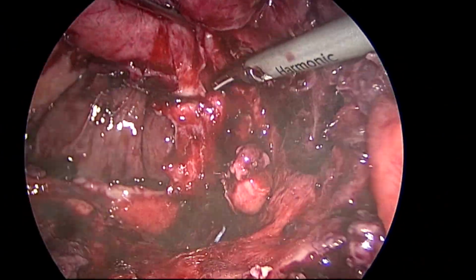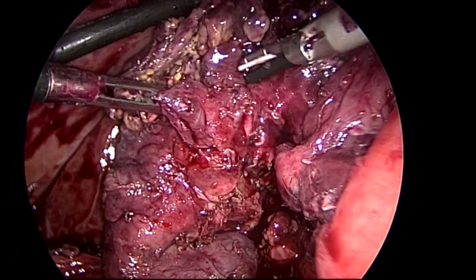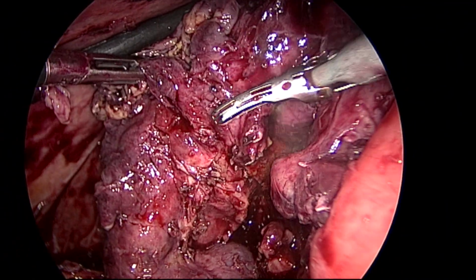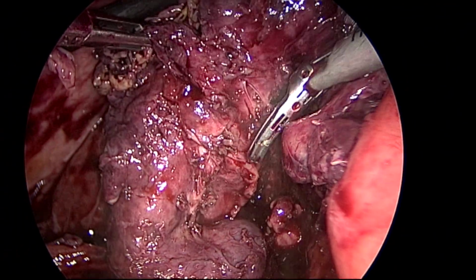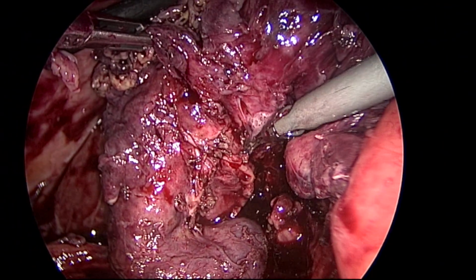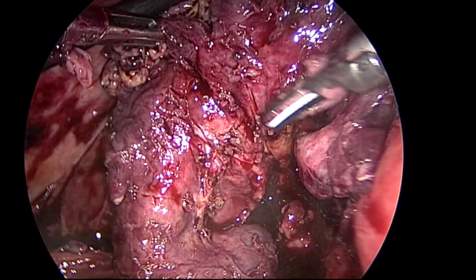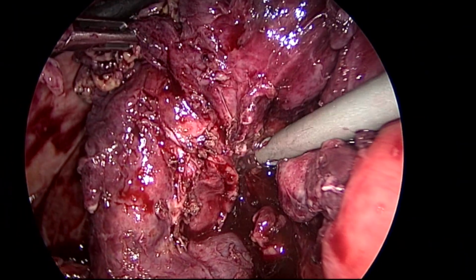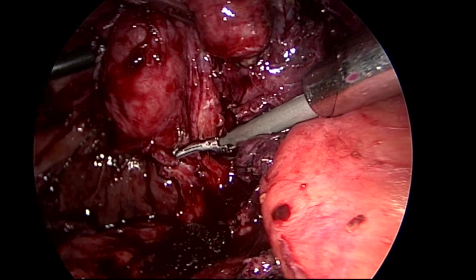Here I am trying to separate the gallbladder from the liver bed, and most of the time now it will be a very densely adherent posterior wall. So I leave the posterior serosal wall of the gallbladder on the liver bed. I am taking the entire anterior wall and the entire mucosa of the gallbladder. So it is called type 1 modification.